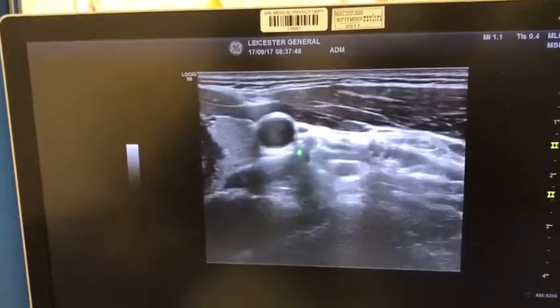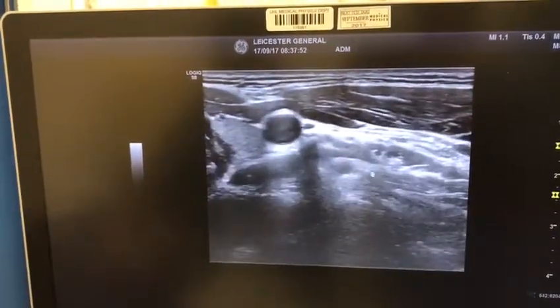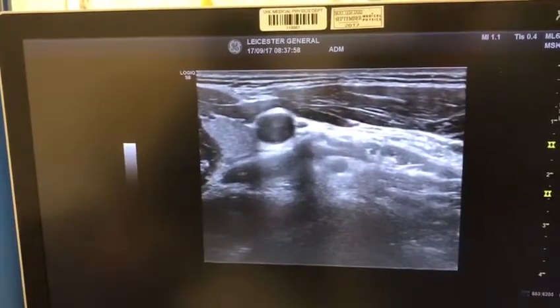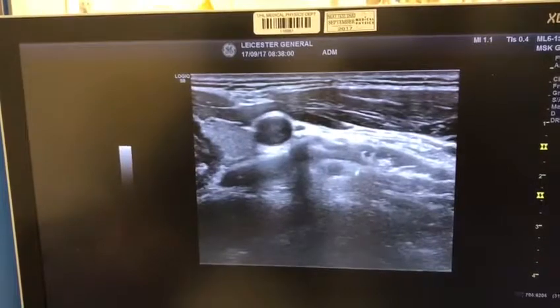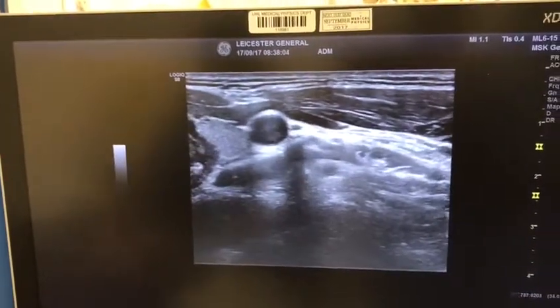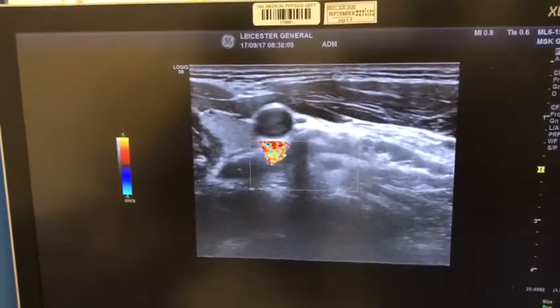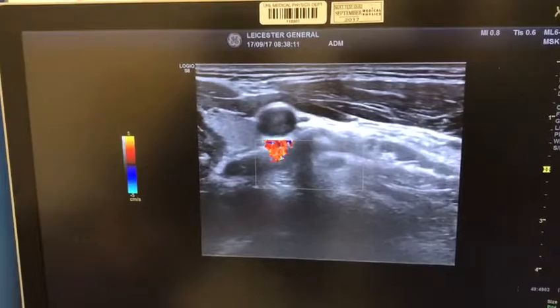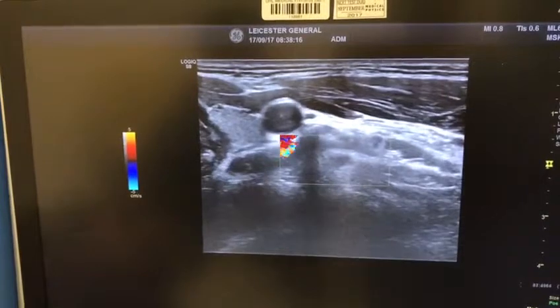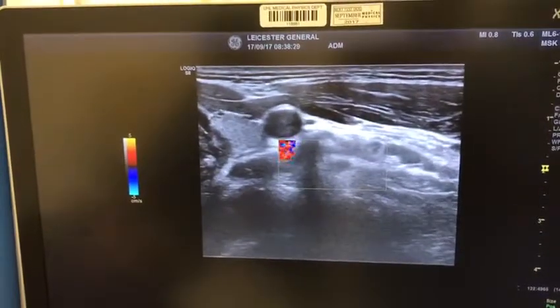It looks like a ghost: anterior tubercle, nerve root, posterior tubercle. To perform the cervical nerve root block, you bring the needle in-plane and stop it just at the posterior tubercle. I always apply color Doppler to rule out any vessels at the entrance to the posterior tubercle. If there are no vessels, the block can be safely performed. The cervical nerve root blocks we perform using ultrasound are essentially extraforaminal injections.